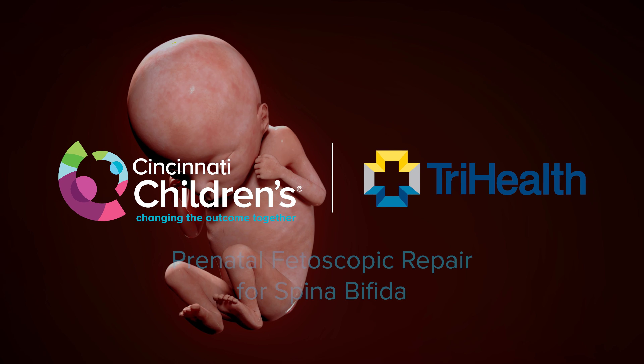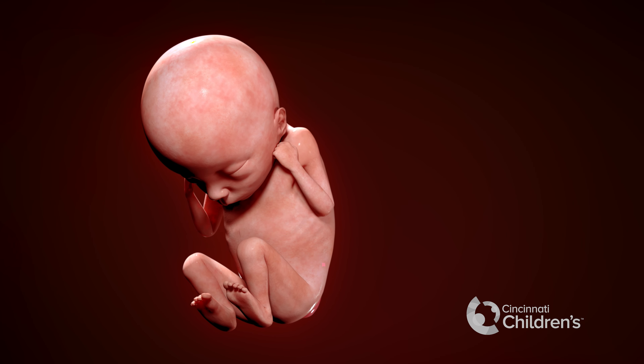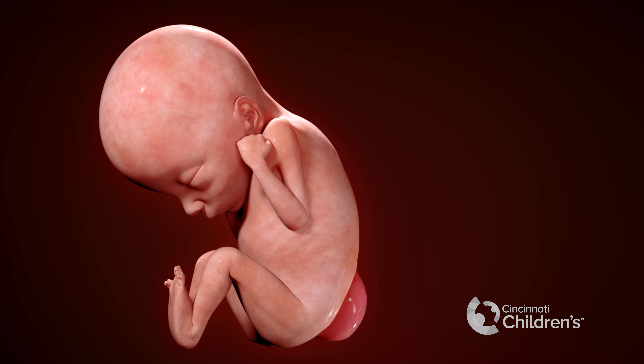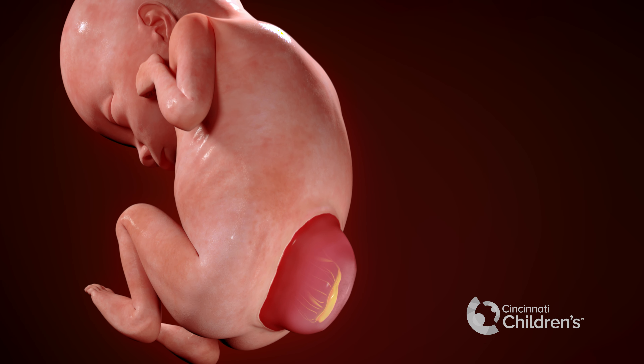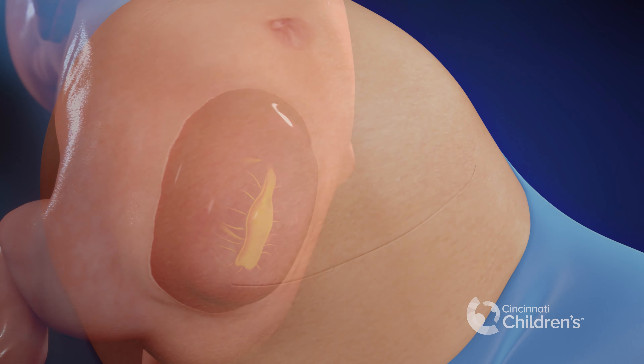This animation shows a spina bifida repair done prenatally using a fetoscopic technique. In this fetus with spina bifida, you can see an opening in the back with an exposed spinal cord. Prenatal repair is most commonly done between 22 and 26 weeks gestation.